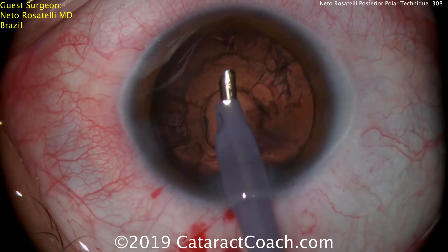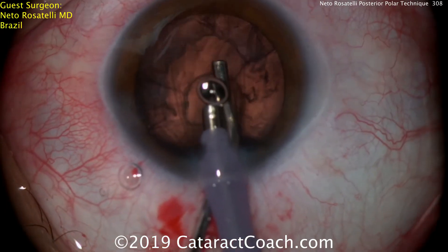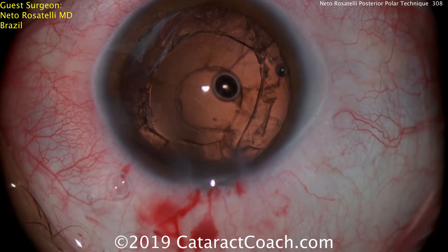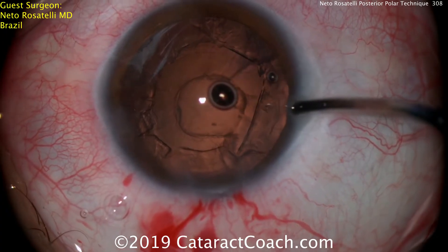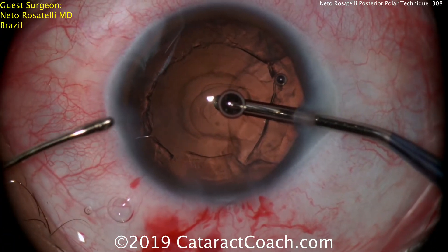That was very interesting and very successful. Now, don't let the anterior chamber collapse — before he comes out with the probe, he fills the eye with more viscoelastic. The reason you don't want to let the anterior chamber collapse is that the central posterior capsule is very weak. If you let that capsule flop and come forward as the AC deflates, you can have a rip in the posterior capsule.